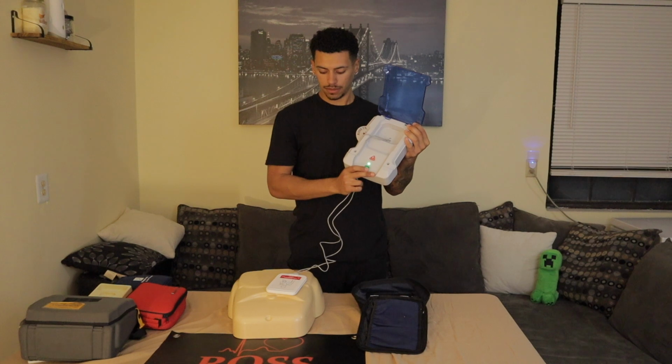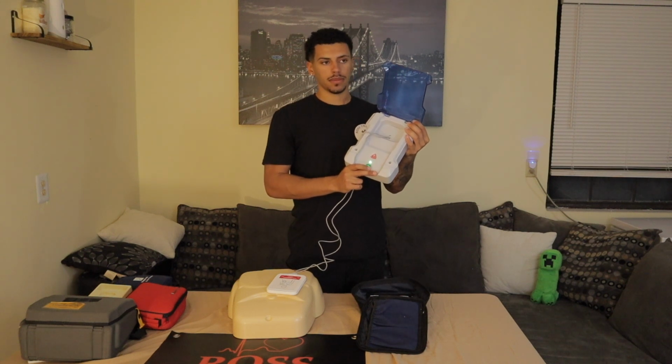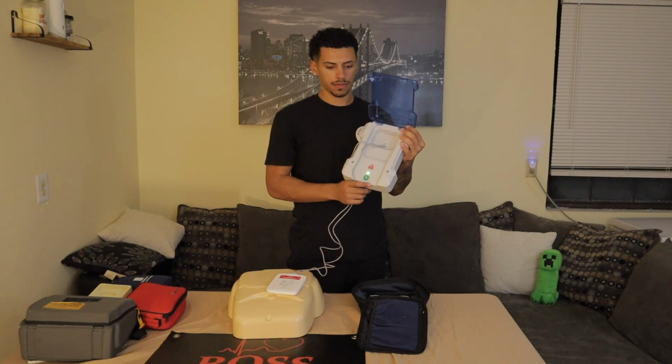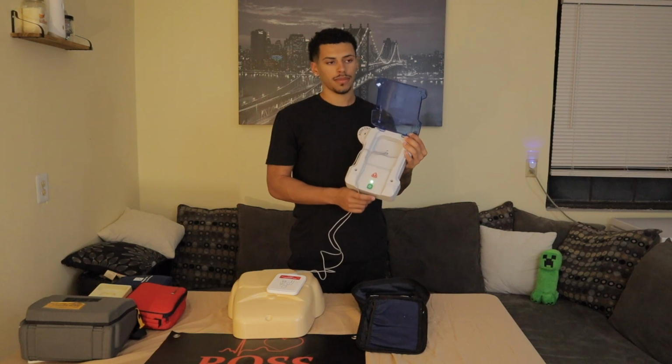Remove clothing from the patient's chest. Open packet and apply pads onto patient's bare skin. Apply pads as shown in the pictures.